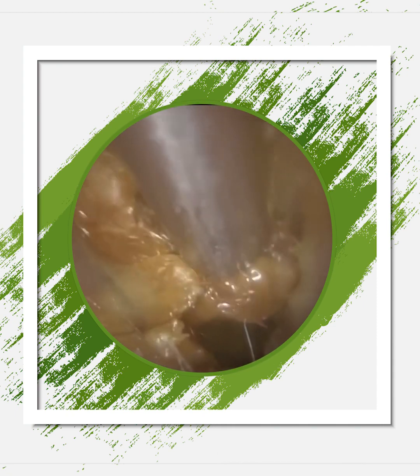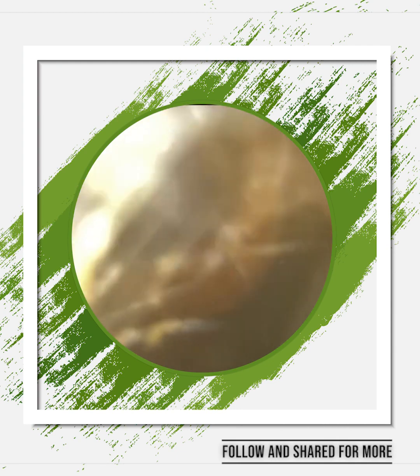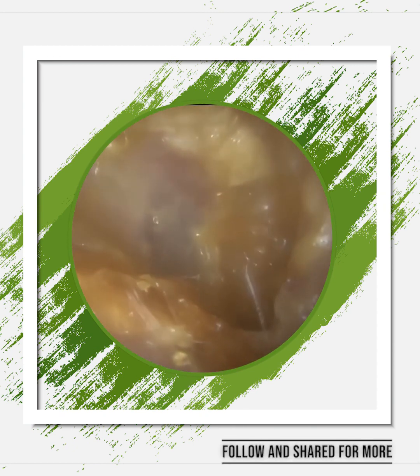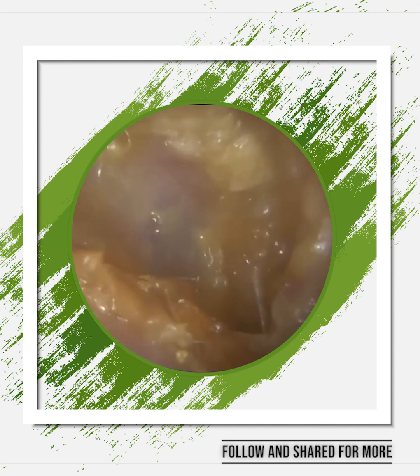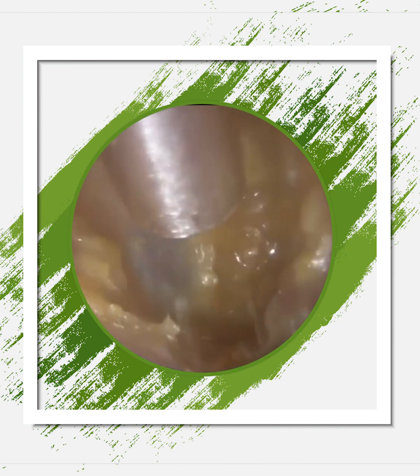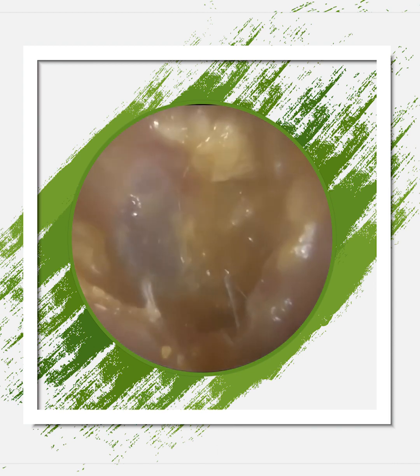Once we've stretched that ear open, I'm then using my dominant hand to very carefully insert the instrument into the ear. At that stage, I'm actually looking into the ear with my naked eye, and I'm looking at the tip of the endoscope, and that's my reference point. The idea is to aim for the tip of the endoscope with the sucker, and by doing that, that prevents the sucker from touching the side of the ear canal as you enter the ear canal, because that can be quite uncomfortable.